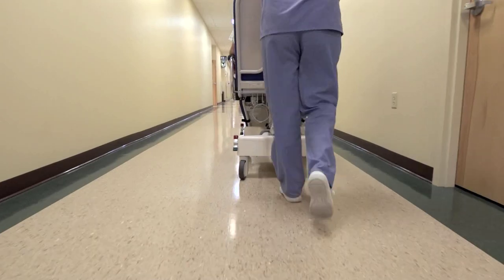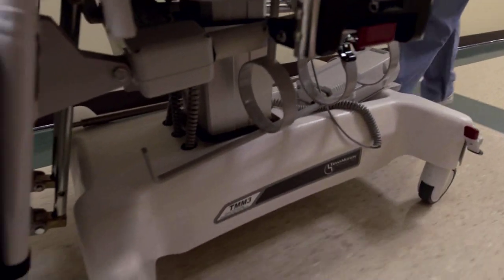This reduces the risk of nurse injury, reduces the risk of patient falls, saves time, saves money, and improves patient comfort.